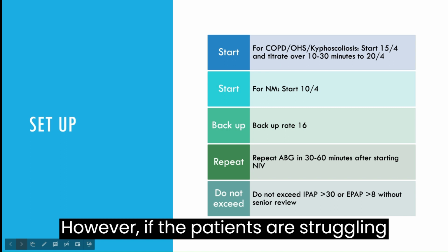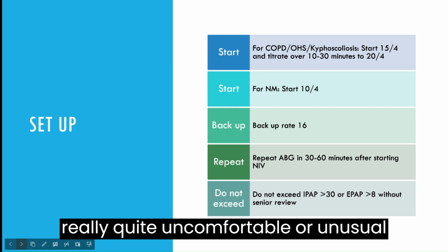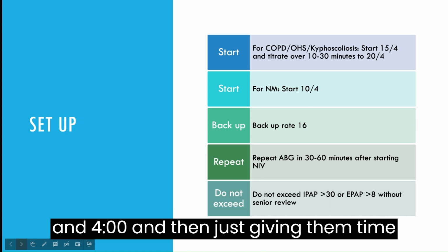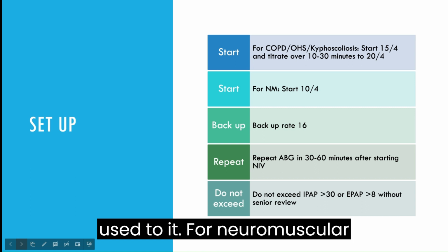However, if the patients are struggling to tolerate the mask, as it can be really quite uncomfortable or unusual for them to get used to, you can actually start lower settings, and I have in the past started at 12 and 4, and then just given them time to sync with the machine and get used to it.